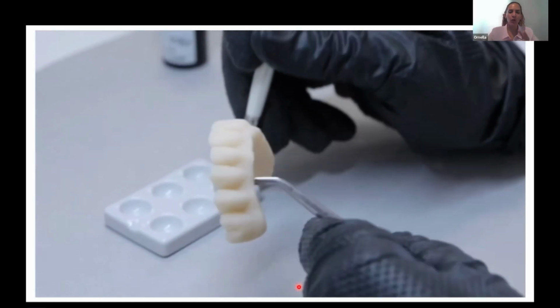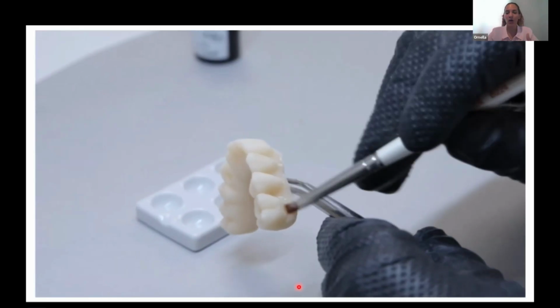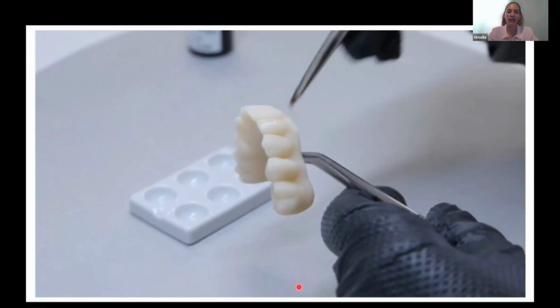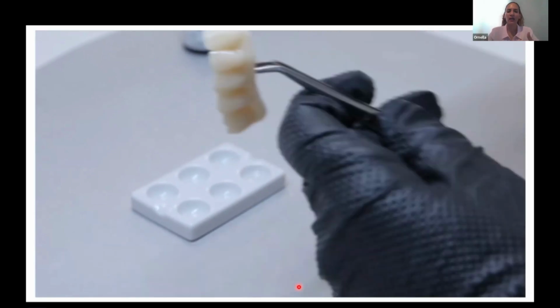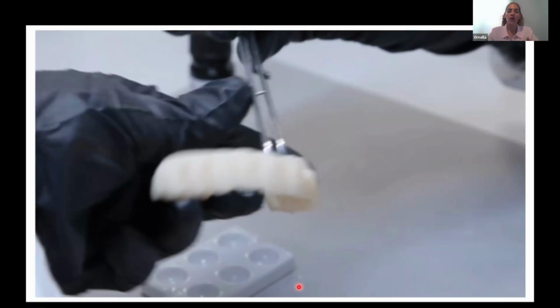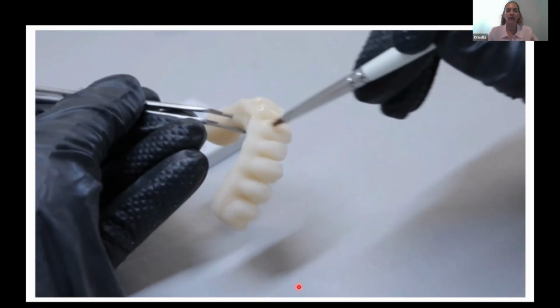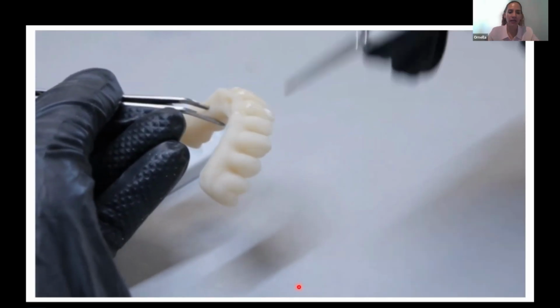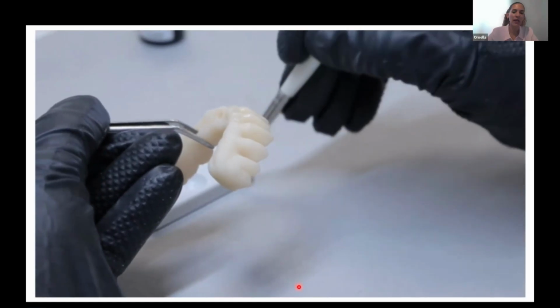So when we see that it's completely evaporated, because my structure is again opaque because of the sandblast, I start applying the adhesive. The adhesive should be any universal adhesive, or for example, if you are using, I don't know, Bredent, you can use Visio.link. If you are using Gradia, that is GC, you can use acrylic primer, okay?